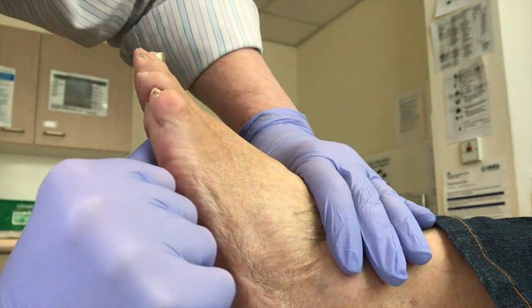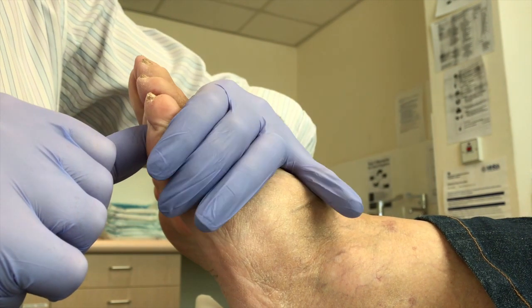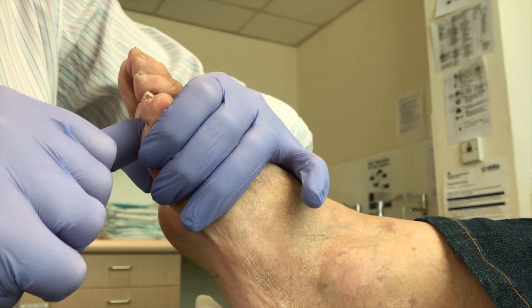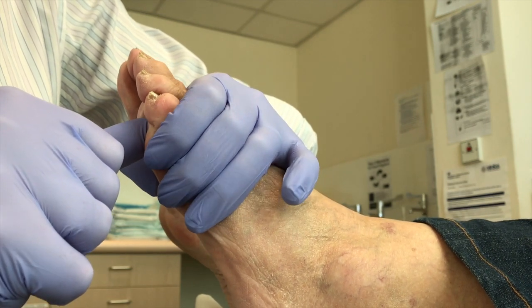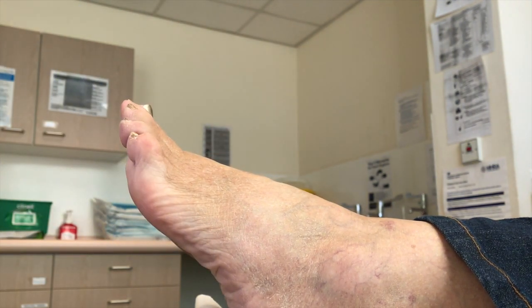In terms of assessment, a bit of side-to-side pressure. I know you can't see that ever so well on the video. Can you see that fourth toe just clunking? I keep doing it until Diane — not her real name — she's saying okay, thank you Mr. Riley, that will do.